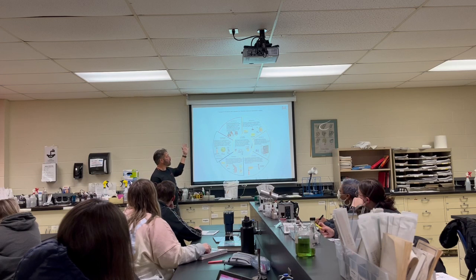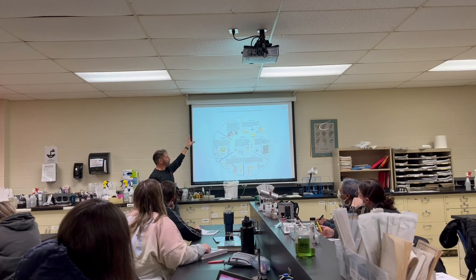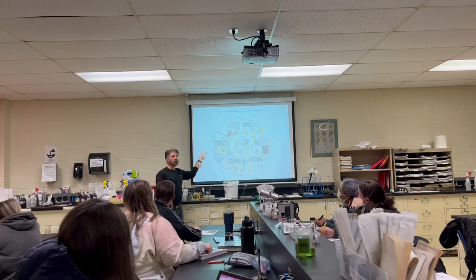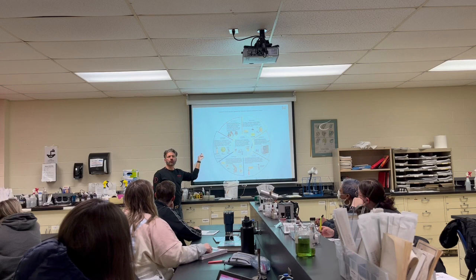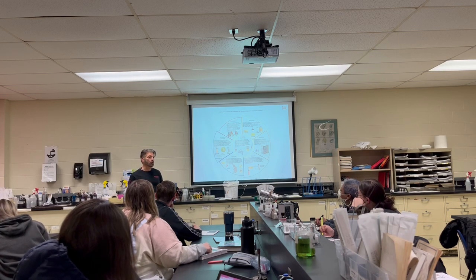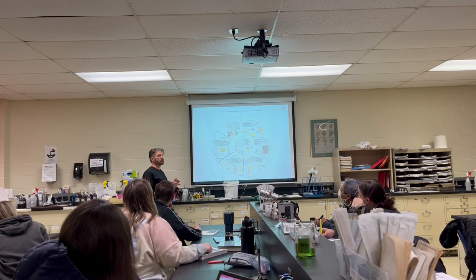So I kind of want to go over the steps in taking a sample. So whether we're looking at a wound, why would we take a urine culture? Yeah, so UTI. All right, so we can figure out in a UTI what's causing that. It could be E. coli, Klebsiella. Usually it's something from the digestive tract that's in the wrong place. So remember last week I said, bacteria is fine if it stays where it belongs, but the minute it goes somewhere where it doesn't belong, it starts causing some major problems.